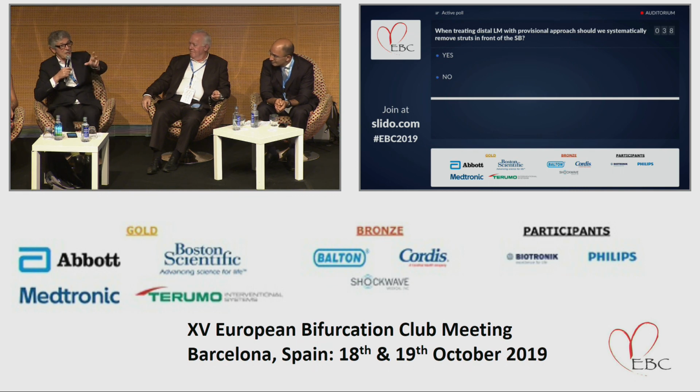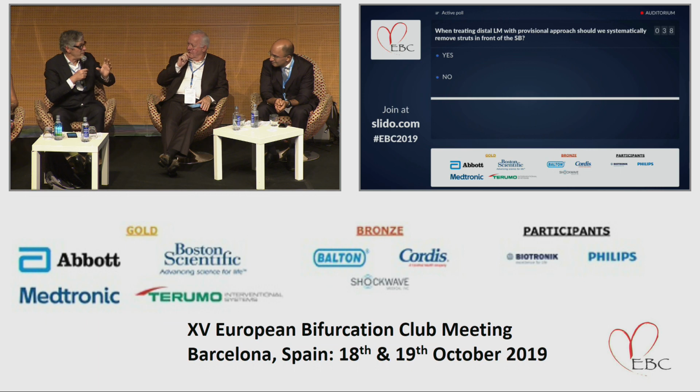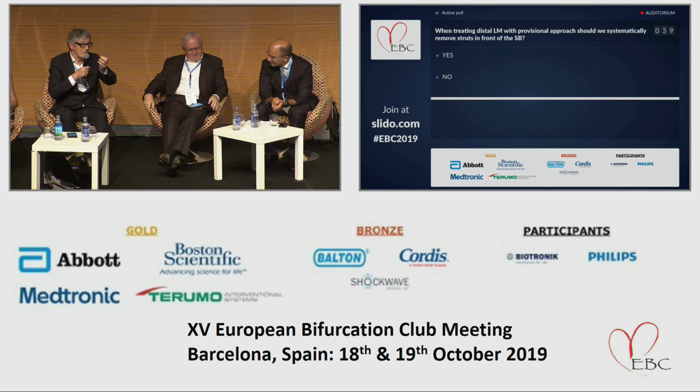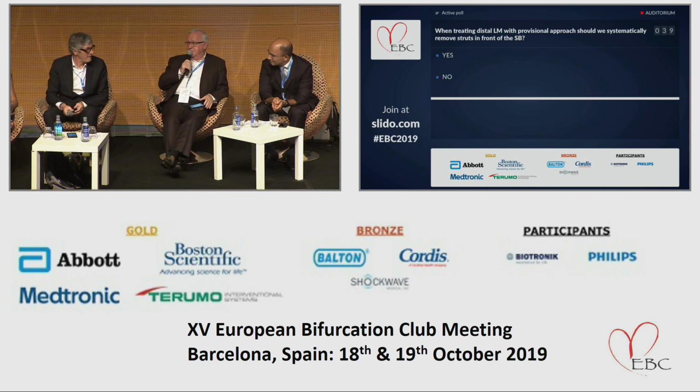But was it? I saw that. So I think it's very interesting because this neoendothelialization of struts was observed before with the bioresorbable platforms. It's very nice because you have pseudo-restenosis, which looks horrible, but which can be treated very easily because you just have to open the strut, whatever the strut you take, of course better to go distal. You will solve the issue by just opening the strut, because the problem is that neoendothelialization of struts. So it's not restenosis, but it looks like restenosis. You see, in the morning... But you may destroy the stent if you do that.